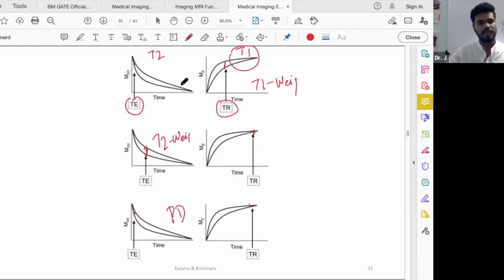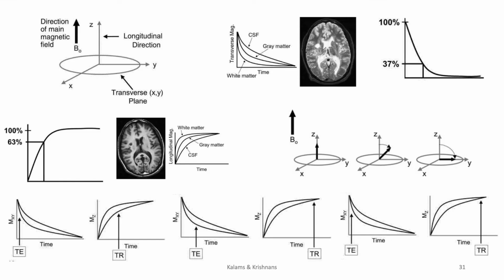So at this point, what we did is we understood what T1, T2 relaxations are and how this weighting shows up. What we took for granted is what these parameters are, what TE is, what TR is. In the subsequent classes, we'll go back and probe the MRI process. We'll answer what TR and TE is. And for today, this is a summary of things that we looked at regarding MRI.